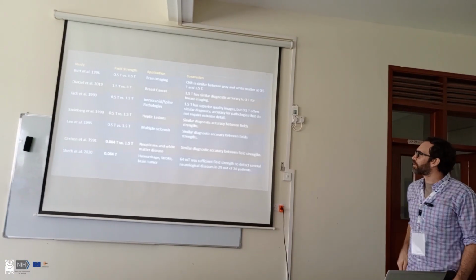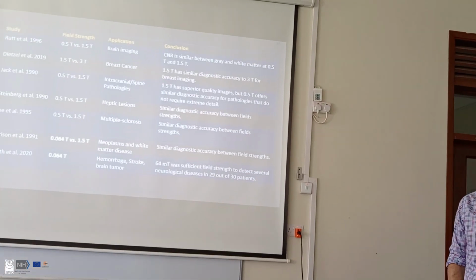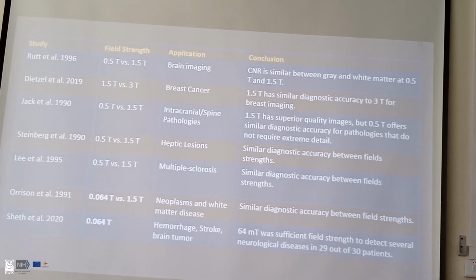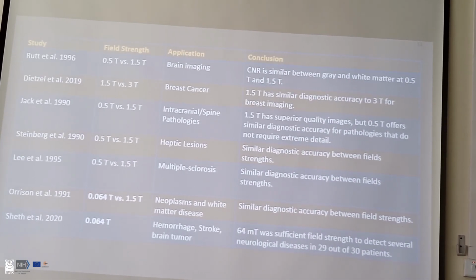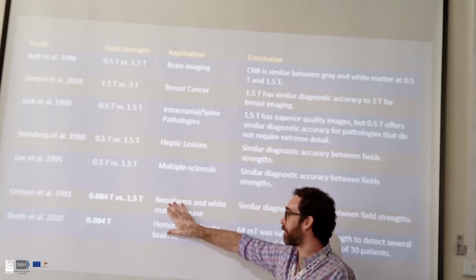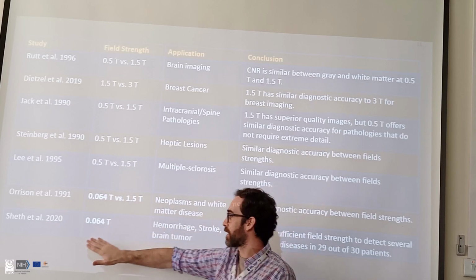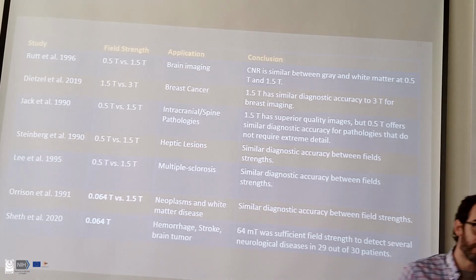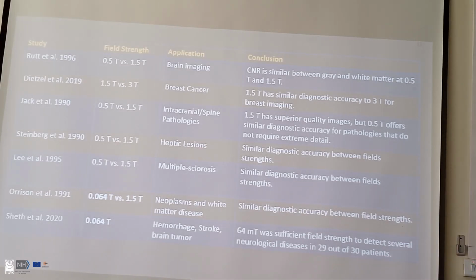And we also know from the literature, I mean, MRI started out as a low field MRI, right? We know from the literature that lower fields can be as diagnostically accurate as higher field MRI for a variety of purposes. And I think the most interesting ones right now are many of the studies from folks using Hyperfine, especially Kevin Sheth, who's a collaborator and a colleague of ours, who's been looking at stroke and different effects from COVID with these systems and has shown them to be quite useful.